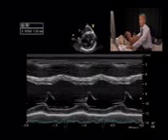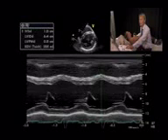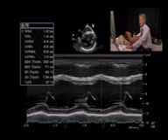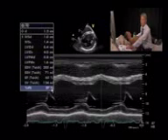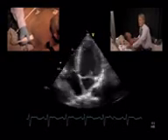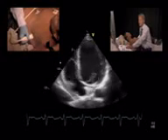So we have an end diastolic diameter of 64 millimeters, which is significantly enlarged, an end systolic diameter of 40 millimeters, and a fractional shortening of 37%. So it's normal to hyperdynamic. This can also be seen here in the four-chamber view. Hyperdynamic left ventricular function. Let's see how large the left ventricle really is.